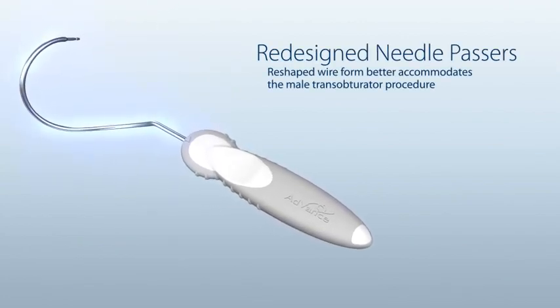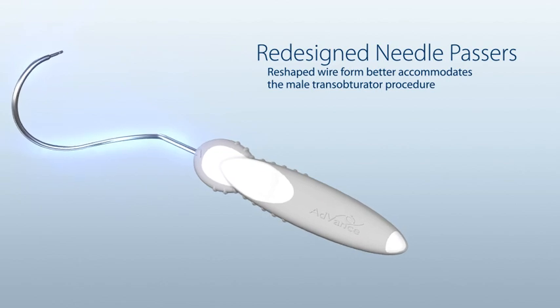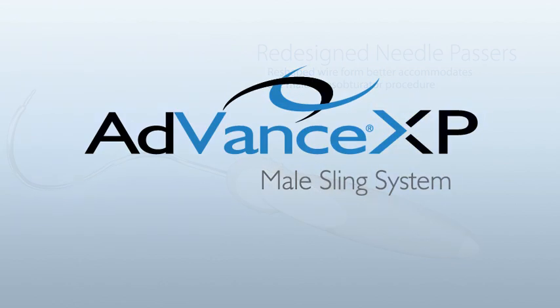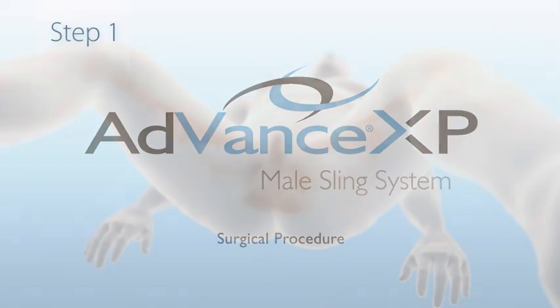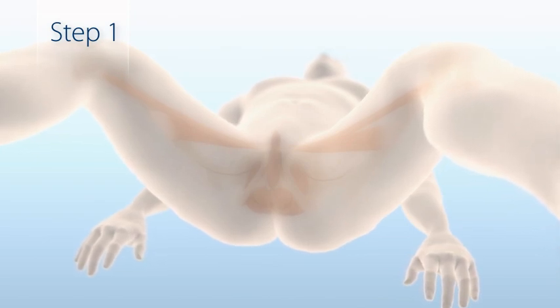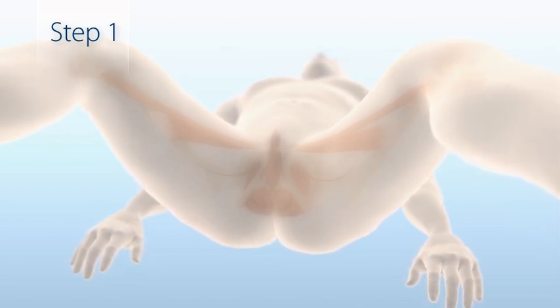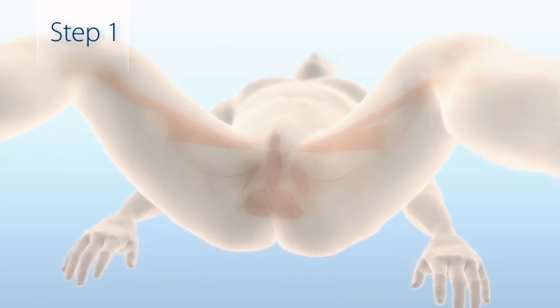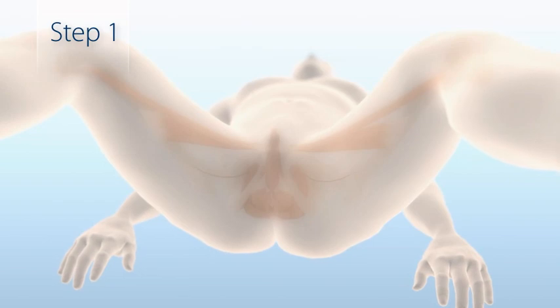Redesigned needle passers. Reshaped wire form better accommodates the male transobturator procedure. To prepare for the AdvanceXP male sling procedure, the patient is placed in dorsal lithotomy position, with legs bent at 90 degrees and slightly spread, no further than shoulder width apart.